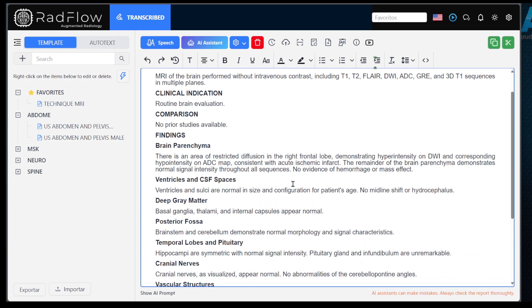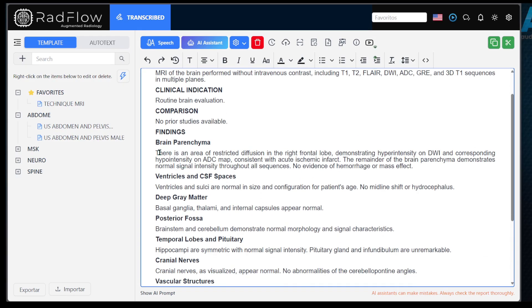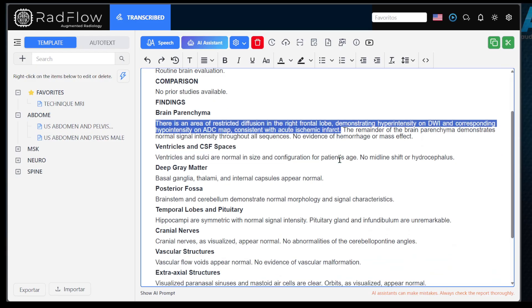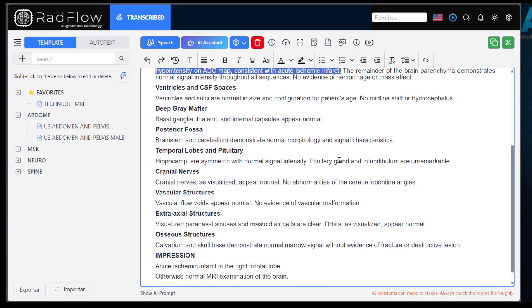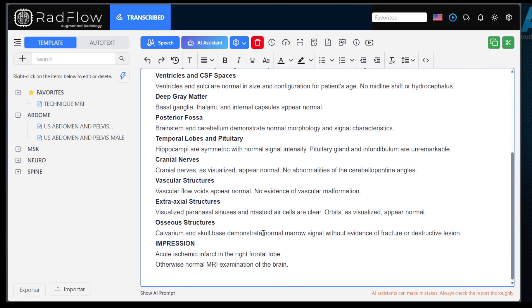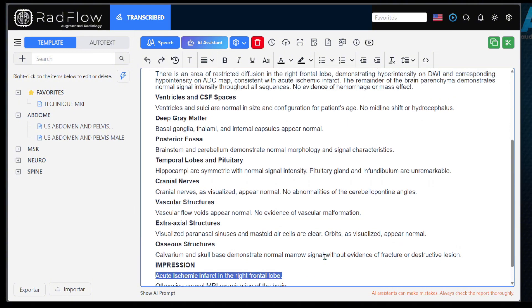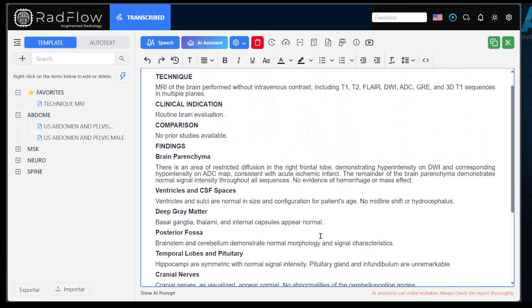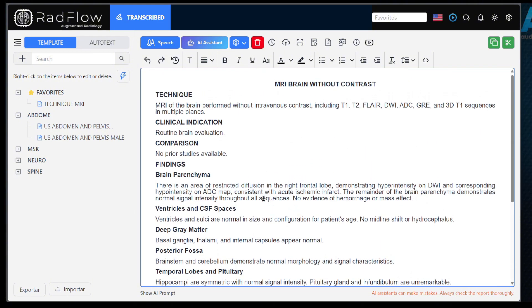Notice that it described the acute ischemic area in the cerebral parenchyma section, and also included this change in the diagnostic impressions. This makes creating reports very practical without needing to edit paragraph by paragraph.